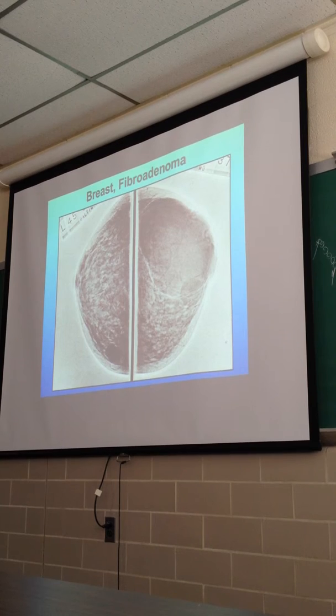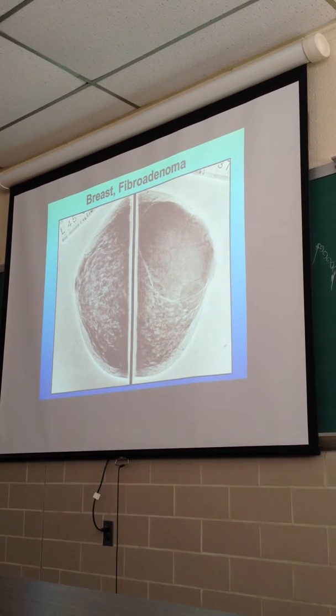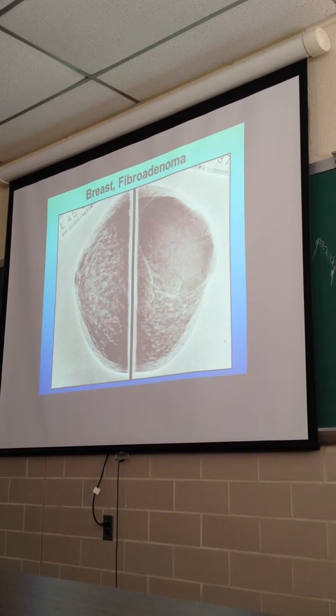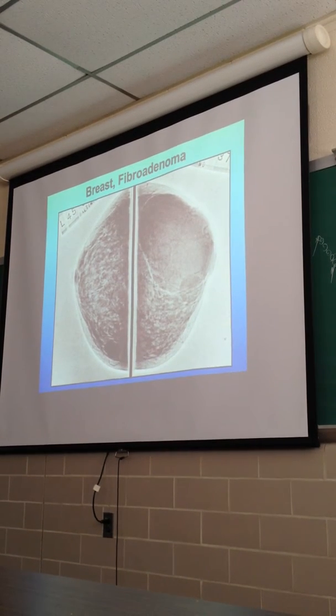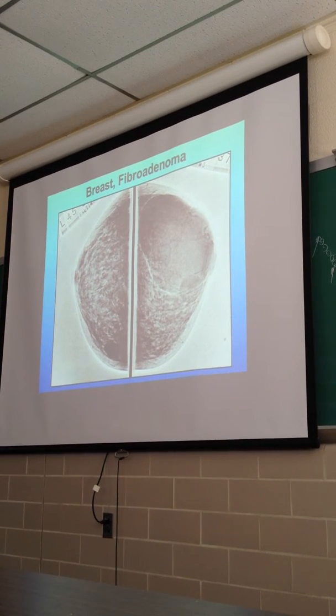And that's actually a fundamental mistake that a lot of MDs make. They say, oh yeah, that looks benign, and they just leave it alone. You could be fooled on a mammogram. You have to have a reason other than the mammogram to suspect that it's benign. Use the mammogram just to check for masses, period, not to make decisions about malignancy. Then you do an excisional biopsy, or you combine it with your physical exam.